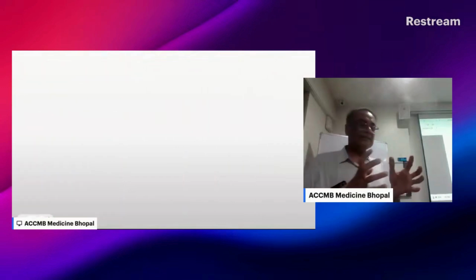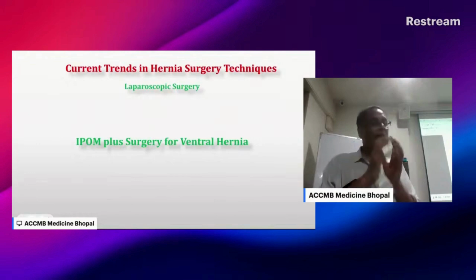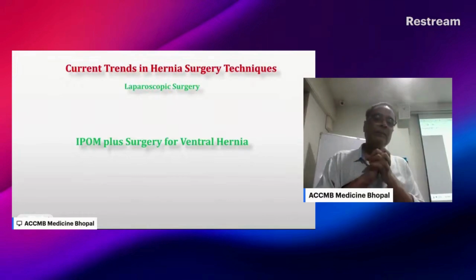So IPOM plus surgery is again a modified form of IPOM surgery, where we have to first close the defect, then after closing the defect, we have to apply the mesh, especially designed mesh for this IPOM surgery.